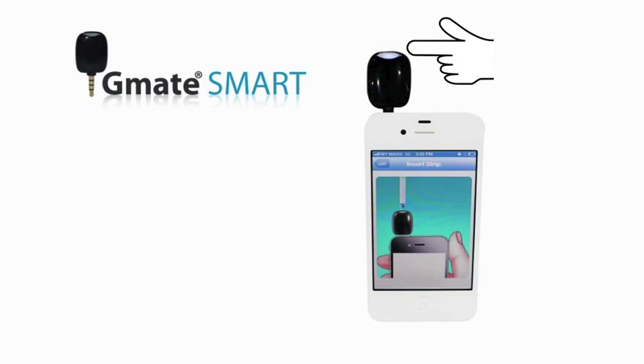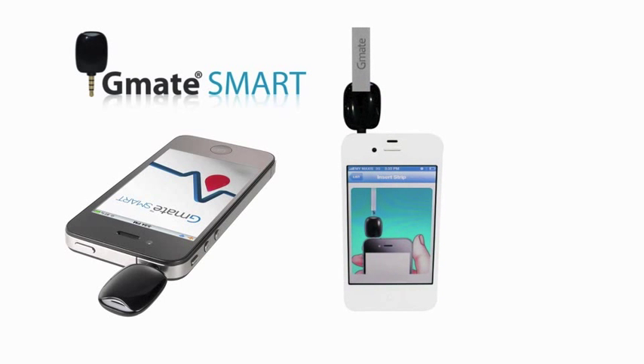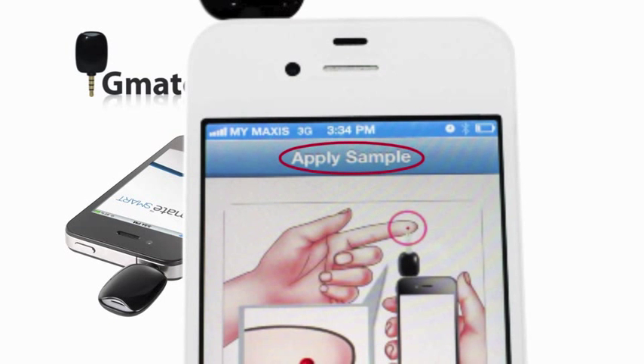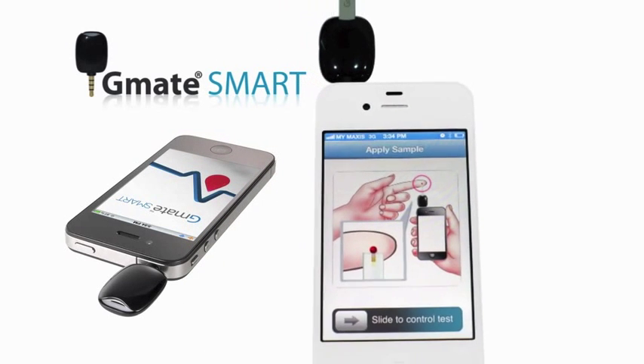The white light will turn on during the meter and 'Insert Strip' will appear on the display. Insert the test strip using gentle pressure. Do not force the strip into the meter. 'Apply Sample' will appear to let you know the meter is ready to be tested.